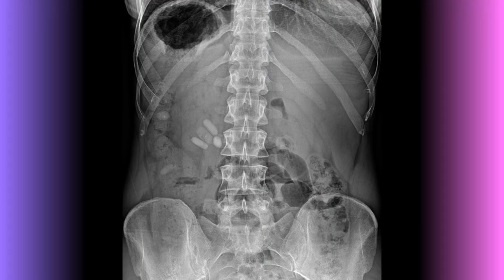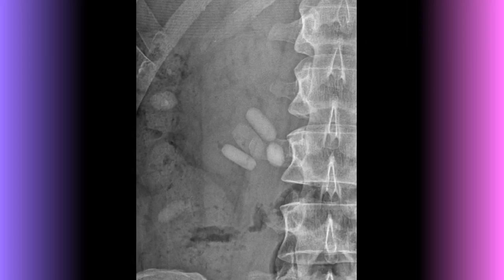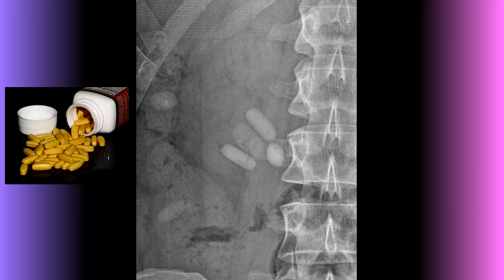On this radiograph, if you believe the large dark spot in the left upper abdomen is the abnormality, please review my video on how not to be fooled by the normal gastric air bubble. Its appearance can be distracting. So what else is on the image? In the left middle abdomen you should see multiple oval densities that almost look pill-shaped — that's because these represent multiple undigested pills.